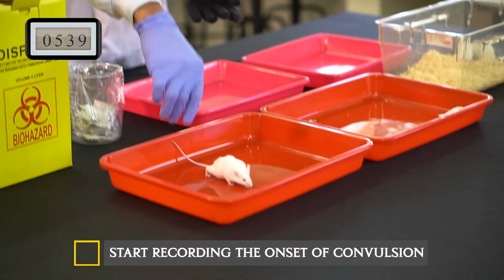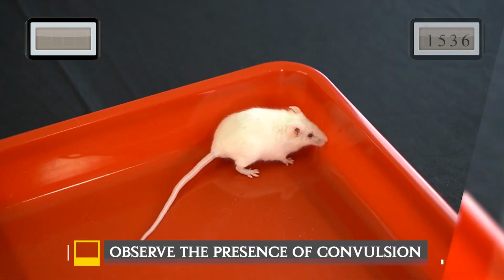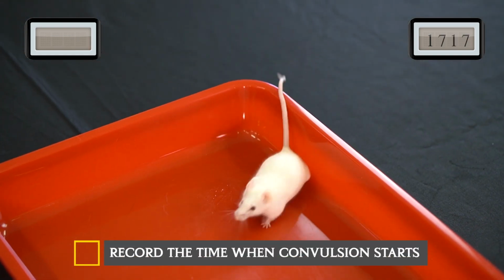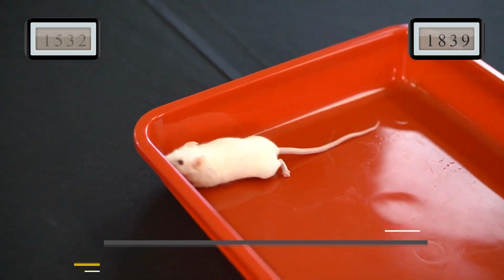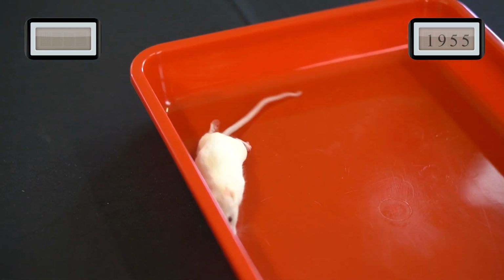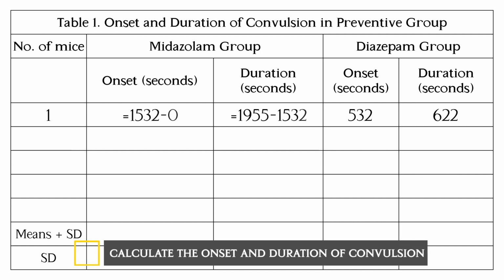Turn on the stopwatch to start recording the onset of convulsion. Observe the presence of convulsion. Record the time when convulsion starts. Record the time when the convulsion stops. Observe and calculate the onset and duration of convulsion occurred in midazolam group.